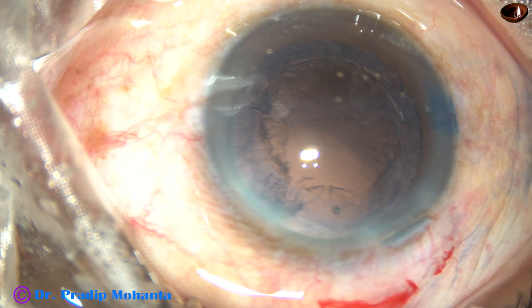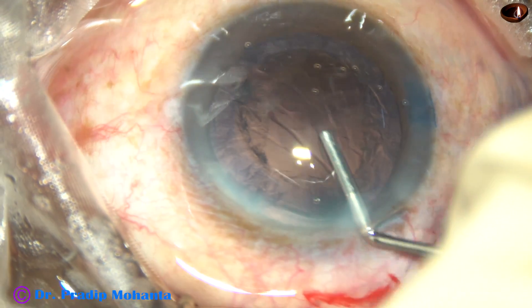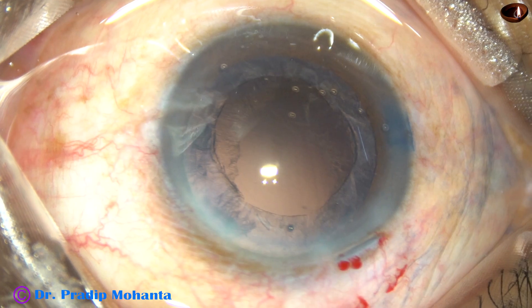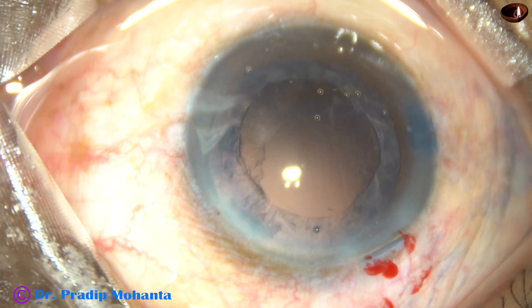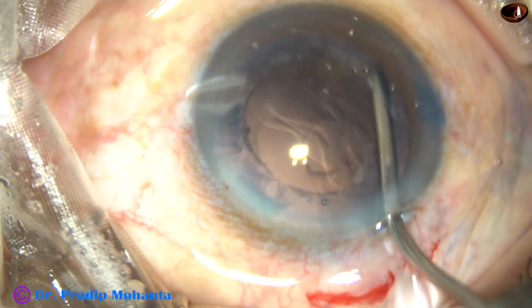Now come out after managing the nucleus and epinucleus and inject viscoelastic substance. One more thing: when you are sculpting, you must sculpt and move — don't move forward without sculpting, and don't push the nucleus.